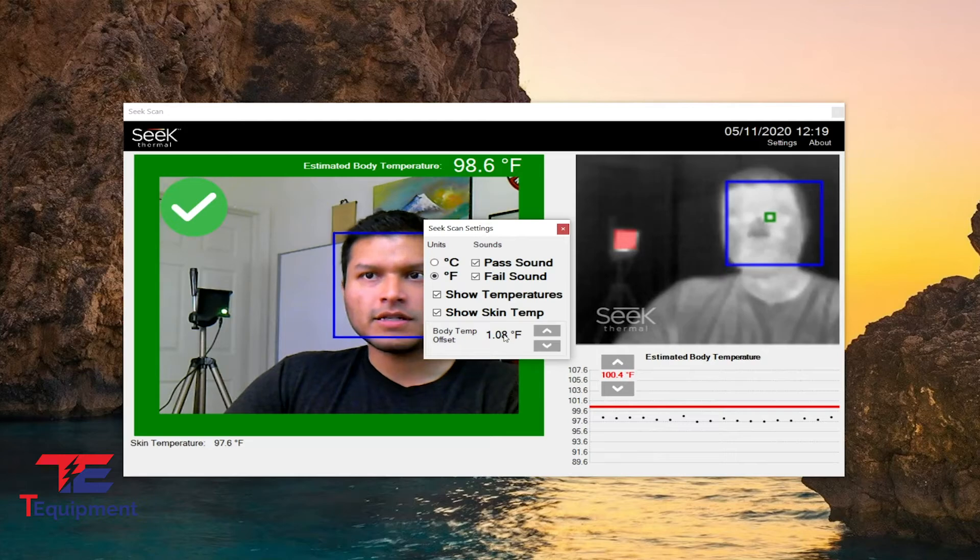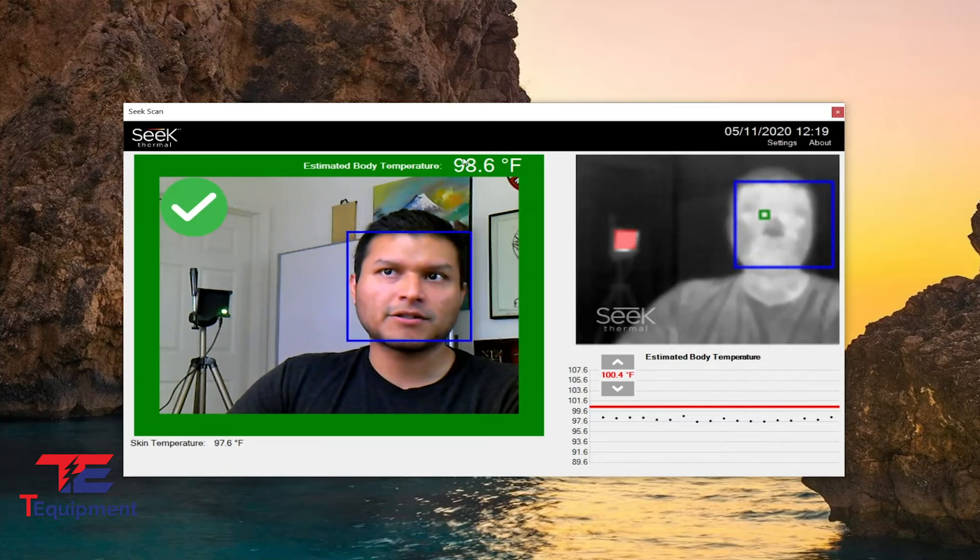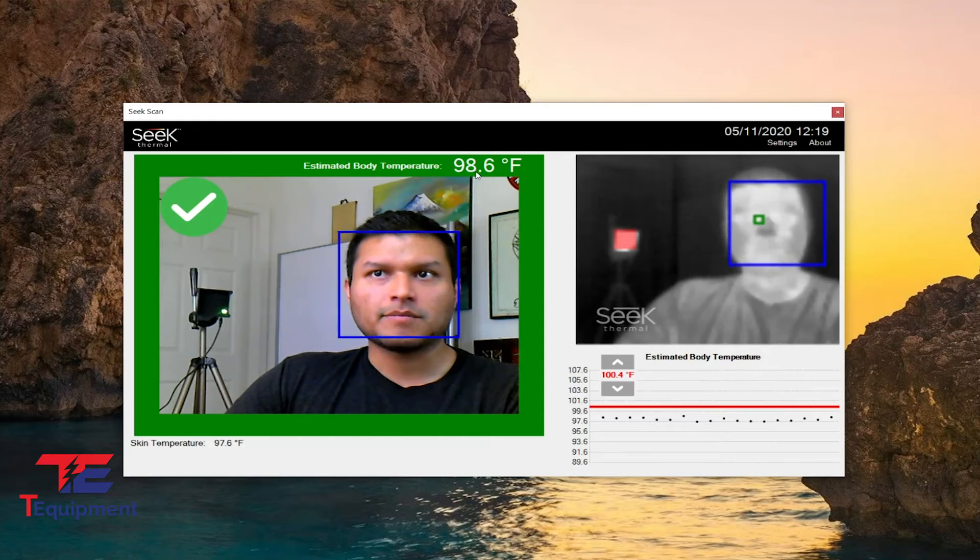The reason for this change is it gives me a better temperature range. Between 97 and 99 degrees is a standard temperature for an adult. So as you can see, I am between 97 and 99 degrees, and my estimated body temperature is correct.